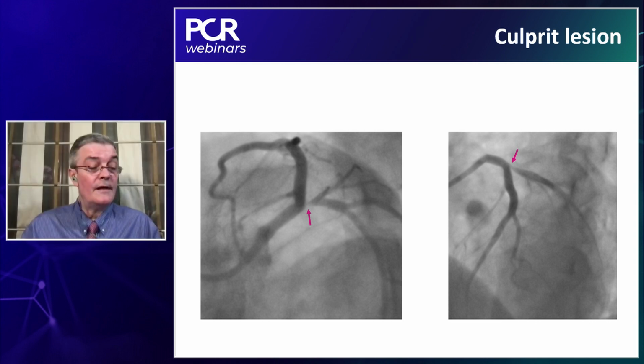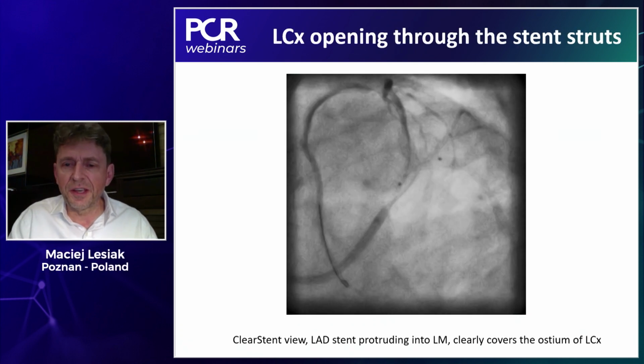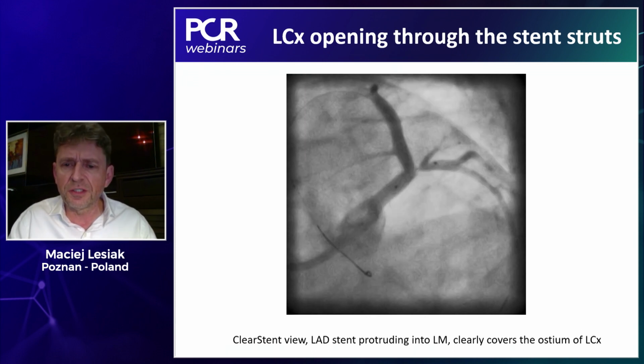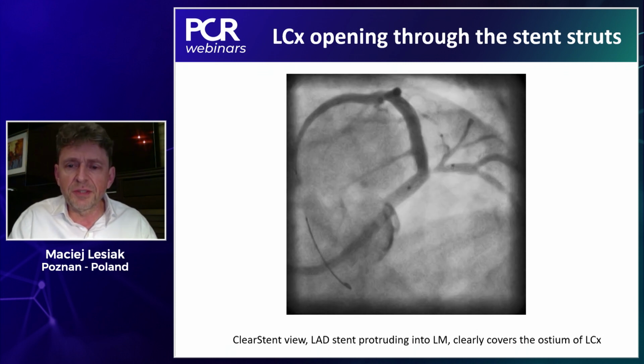Yeah, our colleague is asking, is this new stenosis because of a plaque shift? Maciej, please proceed. You listened to us. You know the rest of the procedure, what you did. Yeah, of course. So first, you can clearly appreciate two things. One, the left main is a very long vessel and free of disease angiographically. So that's the first point.